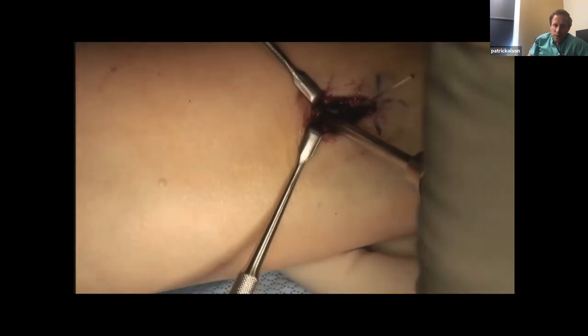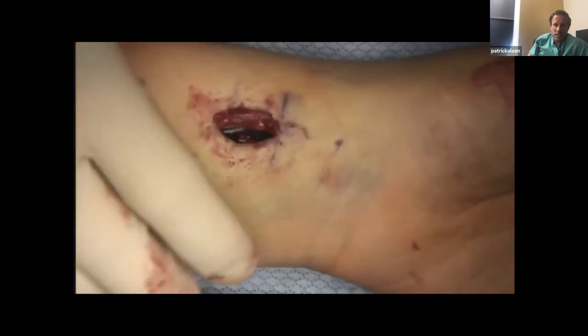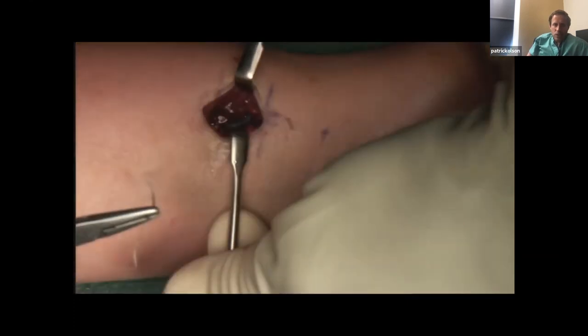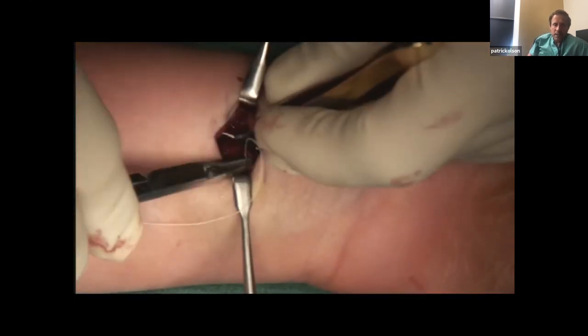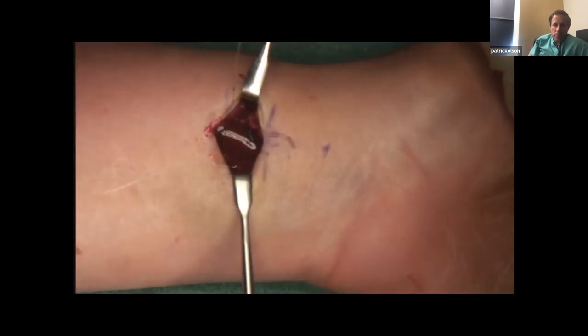I like to do the kickstand screw first when going proximal — that really locks it in. If you do the other screw first then add the kickstand screw, you'll probably have to change out that other screw because it gets a little loose as you get proximal fixation. Now we've got fixation done. Here's the pronator quadratus — this is showing the repair of the pronator quadratus.